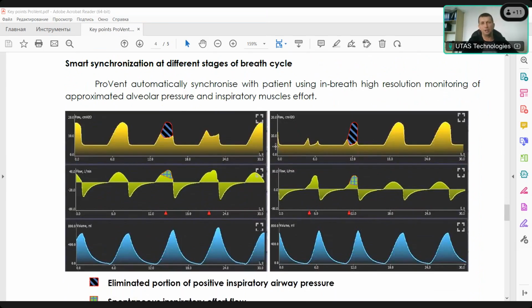But desynchronization happens very frequently, and if we sedate the patient with each occasion of desynchronization, then we will never be able to achieve a successful extubation or a successful weaning. Therefore, synchronization and eliminating factors of fighting with the ventilator have a very important place during the weaning procedure.